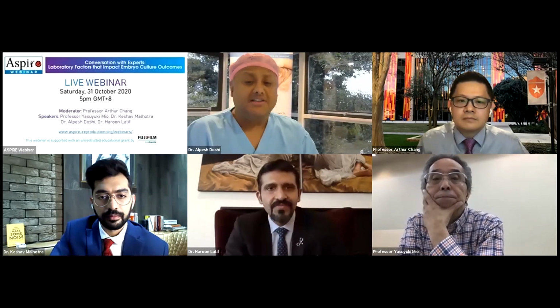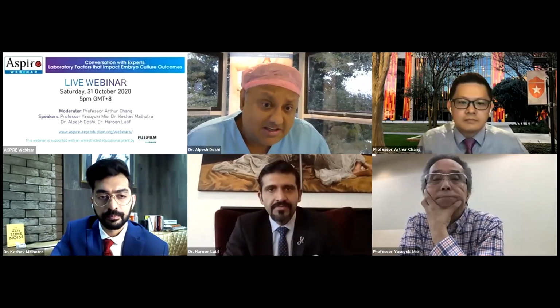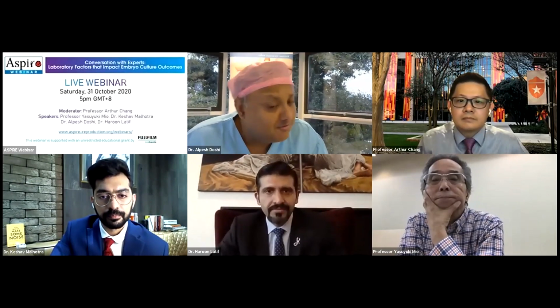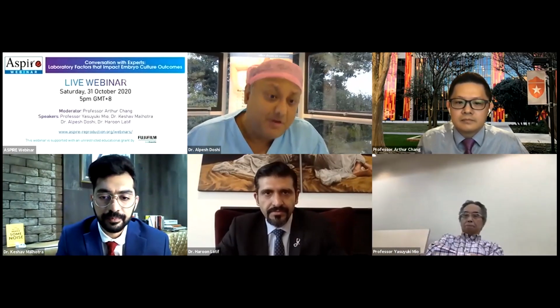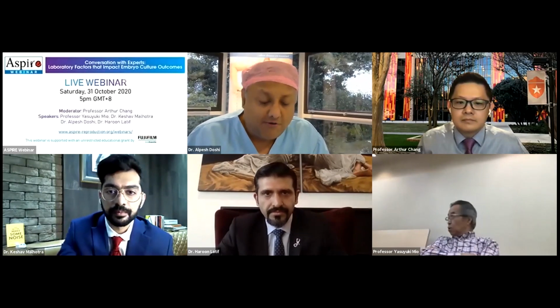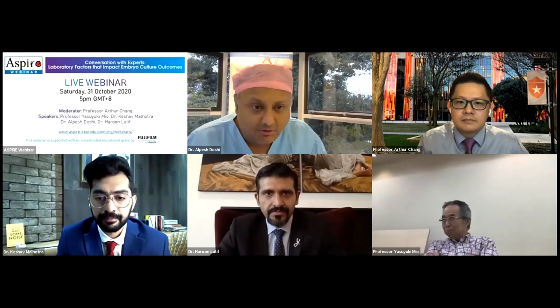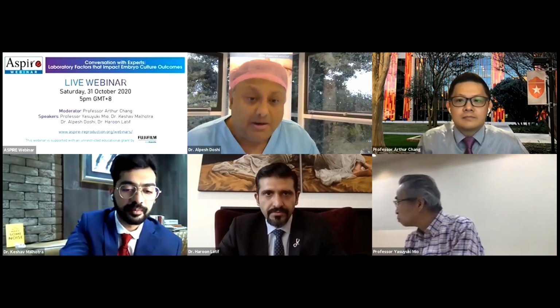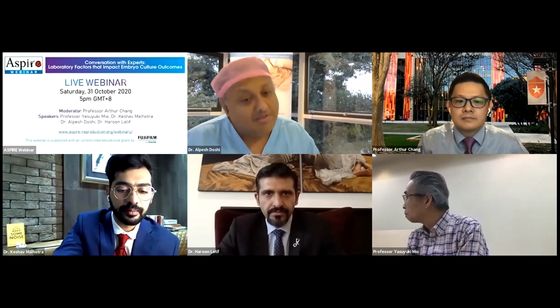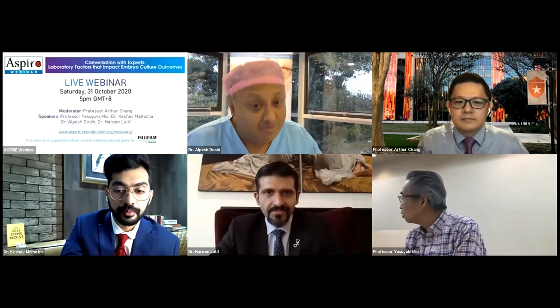It's a very good question, Haroon. It's very difficult to set benchmarks on some key practices such as biopsy because they can be so variable. So for example, one of the KPIs that we use for biopsy, because again, from a regulator's perspective, we need to be collecting KPIs. So for the biopsy practitioner, the KPI is what we call re-expansion. So when we're training embryologists for biopsy, we make them biopsy the embryos and then see how many of those embryos re-expand. And when they re-expand, we consider them as survived the biopsy. And that should be over 85 to 90%.